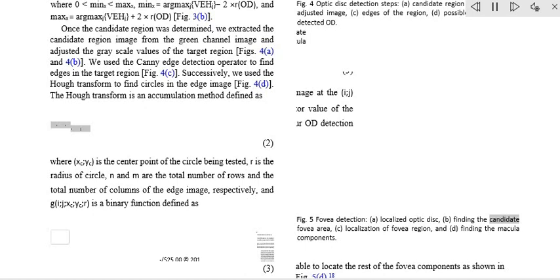Zernike moments. Zernike polynomials [20] are used to extract the global shape information of an image. They provide robust shape information that is invariant to rotation and scale. In mathematics, the Zernike moments are orthogonal moments that use the unit vector representation of an image. They are denoted as in the following formula.